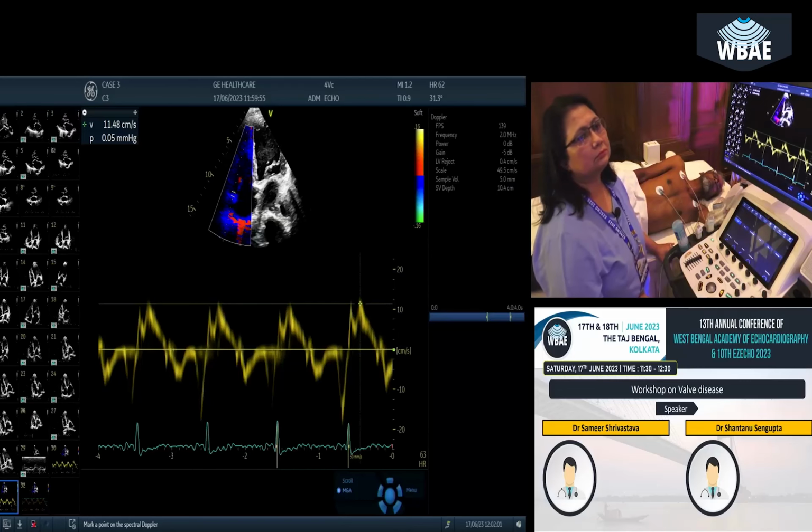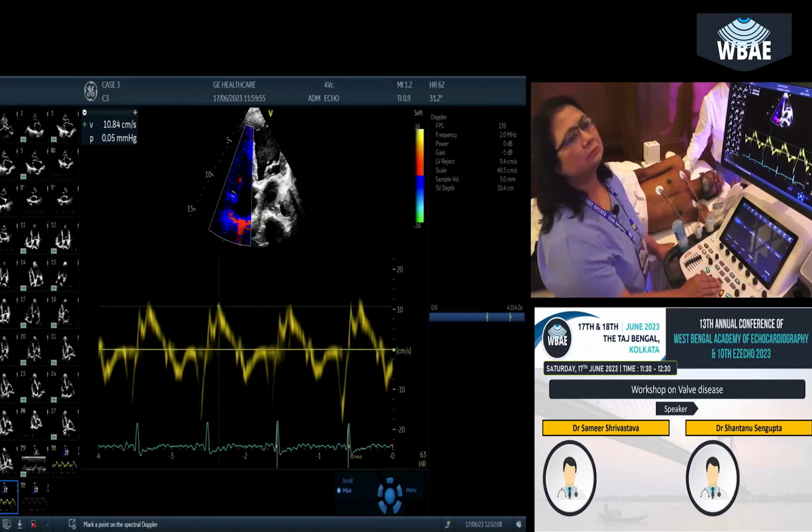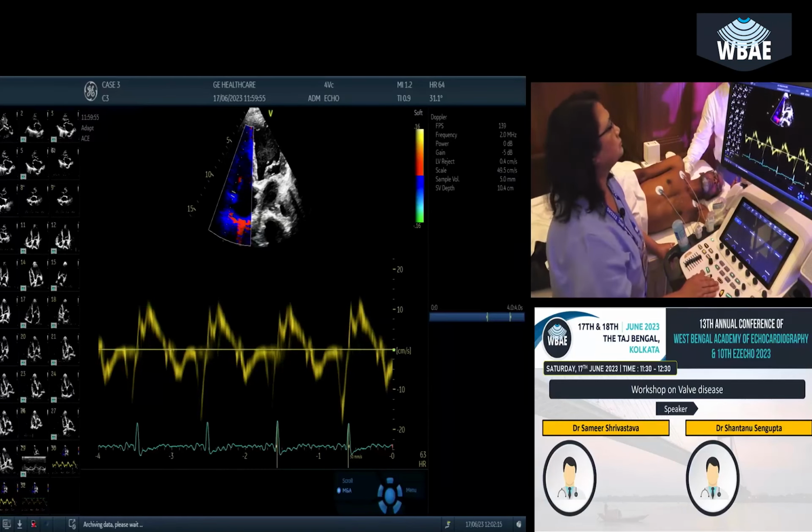In fact, I probably might take slightly lower down, but instead of 11.4, it may be 11.2. It doesn't matter, it doesn't make much of a difference. But whatever you do, you should have a consistent method of doing it. I think your lab should be consistent with that. That's the point. Okay, let's go to strain. We'll finish off the RV.